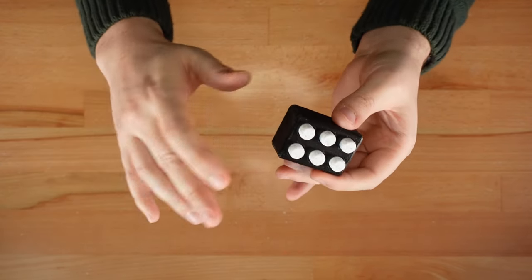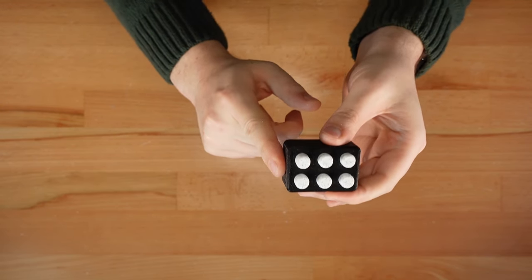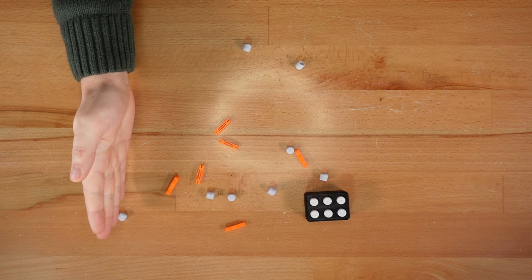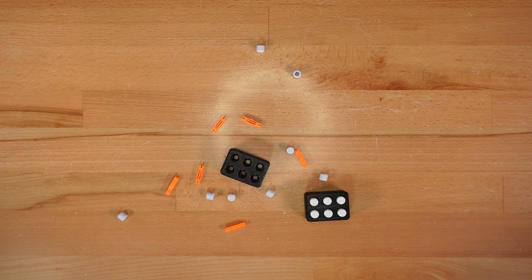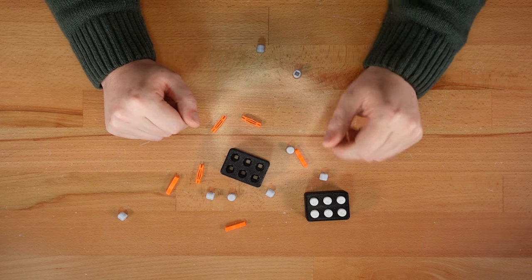First, the design is way too complex. Each cell has 19 individual parts: 6 springs, 12 button caps, and a case to hold everything together. That's a lot to print and assemble, especially if you're making multiple copies.